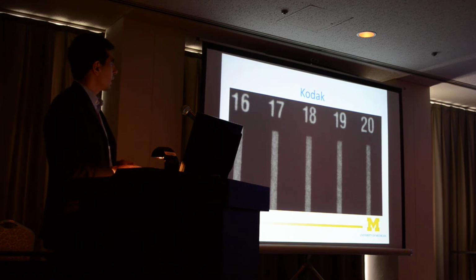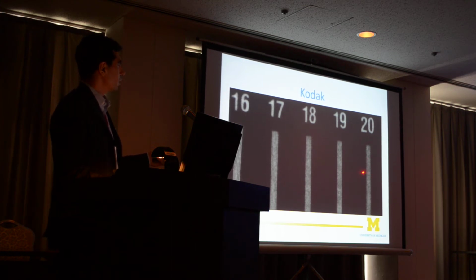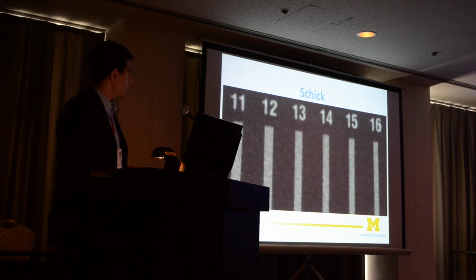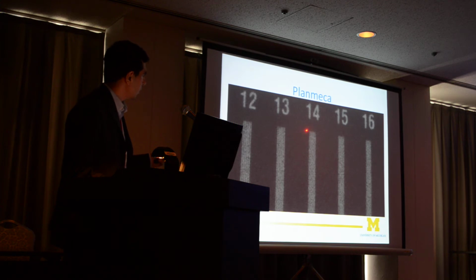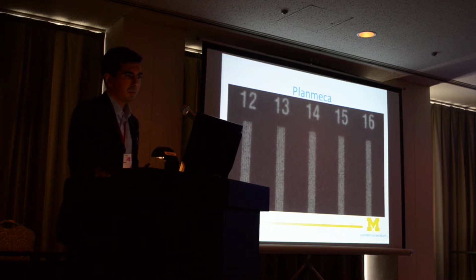The highest one was the Kodak sensor. We were able to see and distinguish all the lines from top to bottom at 20 line pairs per millimeter. I zoomed in a lot here, so it probably looks better on a computer monitor compared with a projector screen. This is the Schick sensor, and you can probably get between 13 to 14 line pairs. I also have an image from Planmeca, and 14 looks okay, 15 looks okay in some parts, but you lose some of the details in other parts. So we always use the lowest number where you can see the entire lines from top to bottom.